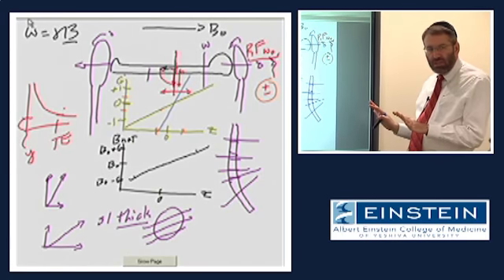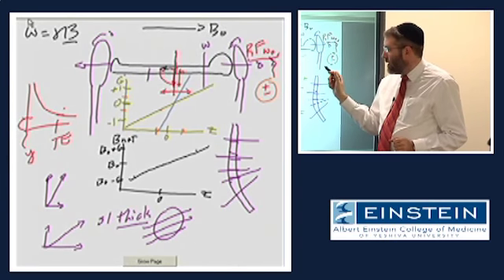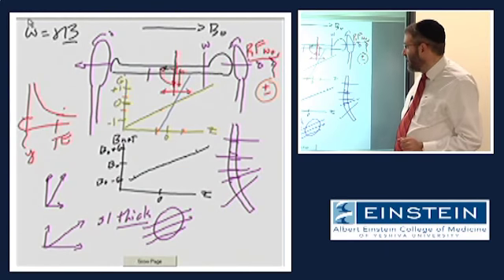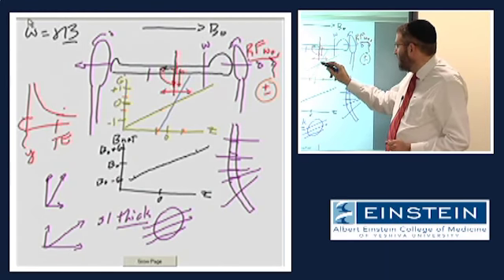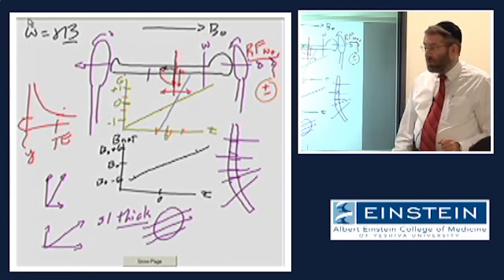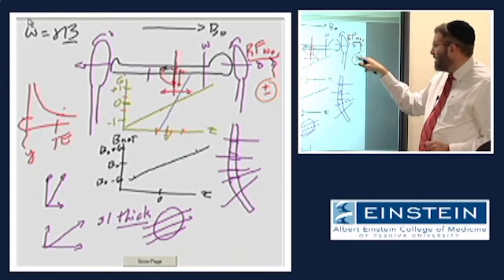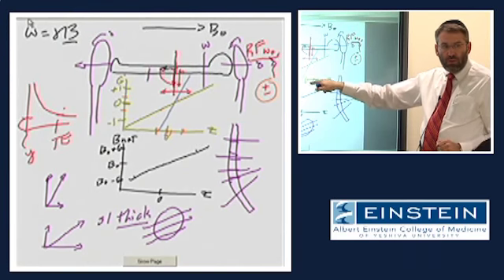If we leave everything the same, transmit the same range of frequencies, but ratchet up the slope of this gradient magnetic field, all of a sudden, the range of locations across which we have the same range of field strength and therefore frequency becomes much narrower.